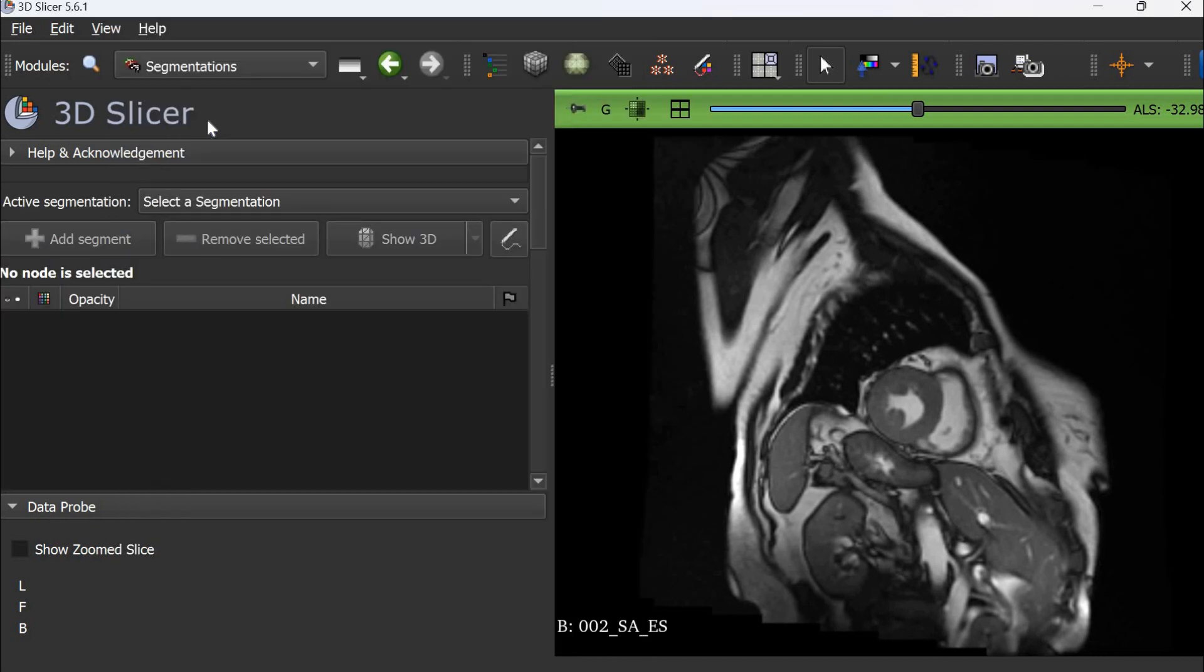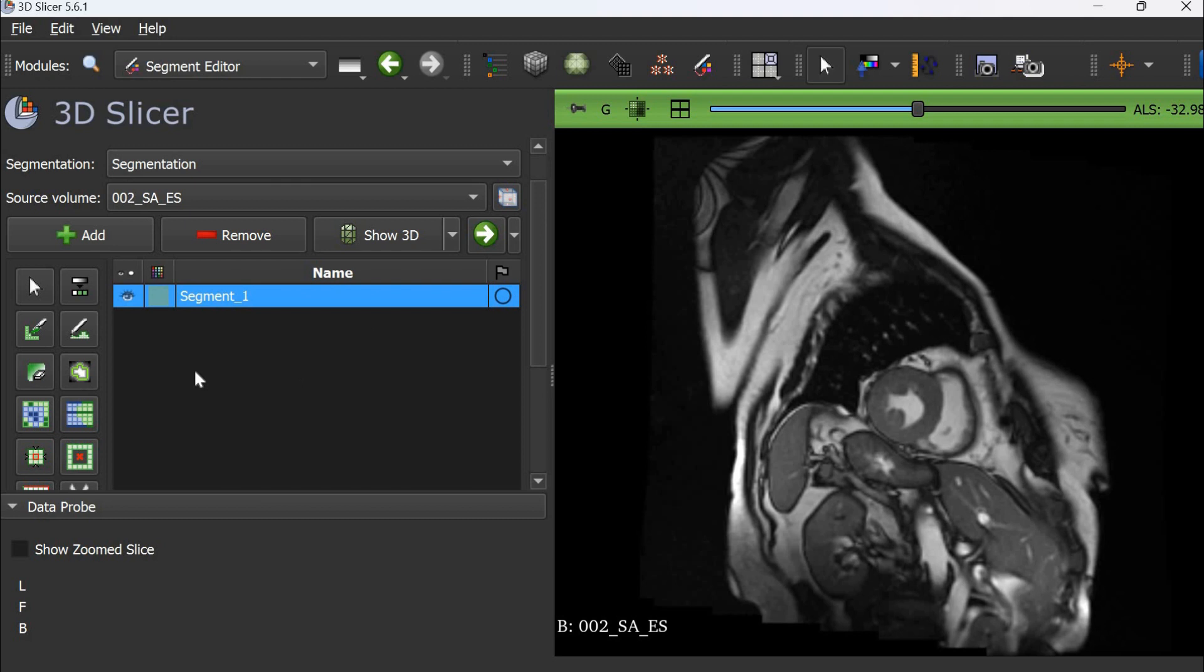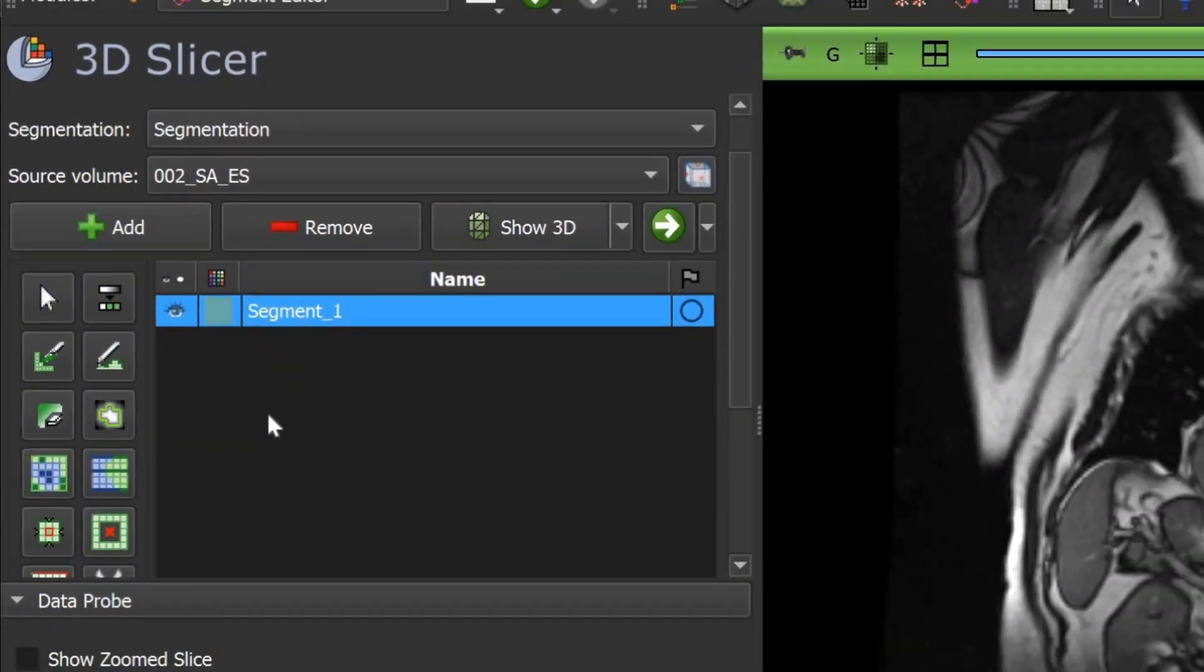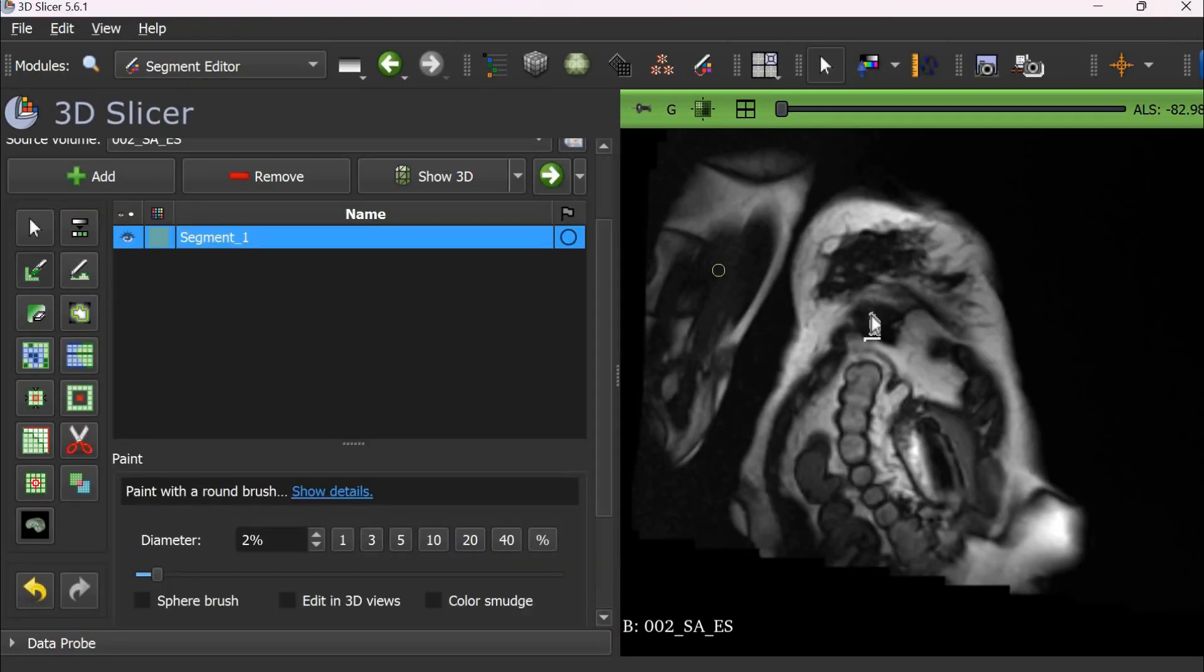There are no masks so we create a new one by clicking here. We have these tools available to create segmentations. The first tool is the brush. We select the brush then go to the slice where we want to create mask.